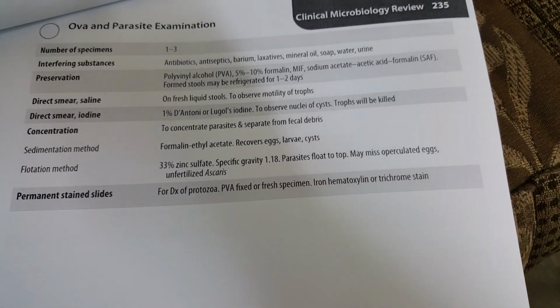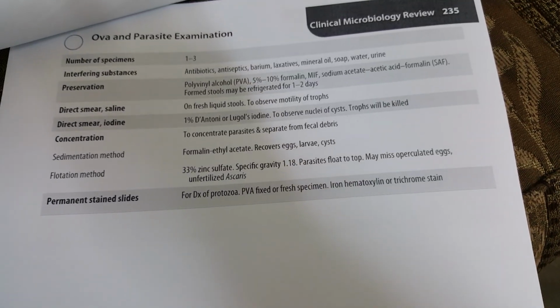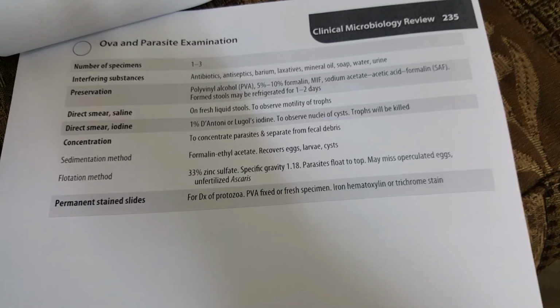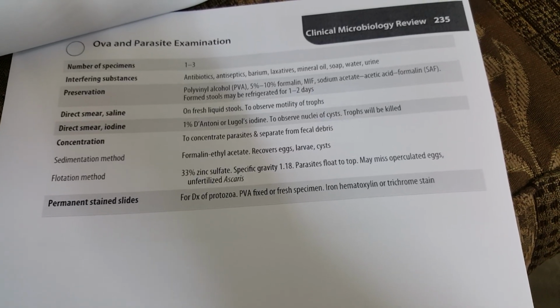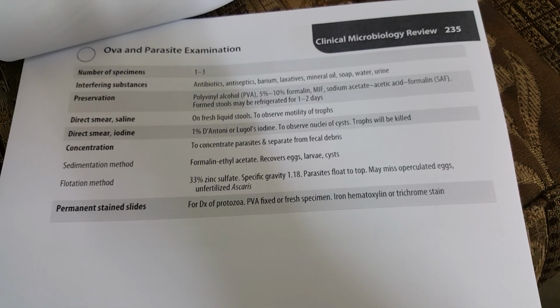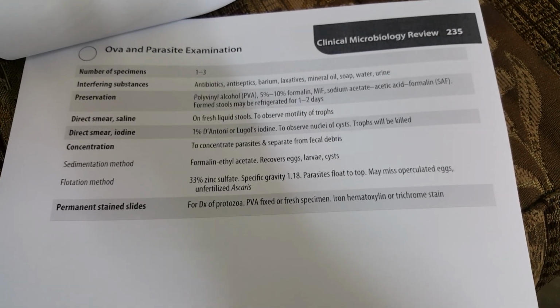For the ova and parasite examination, the number of specimens must be 1, 2 or 3. Interfering substances in this test are antibiotics, antiseptics, barium, laxatives, mineral oil, soaps, water and urine.